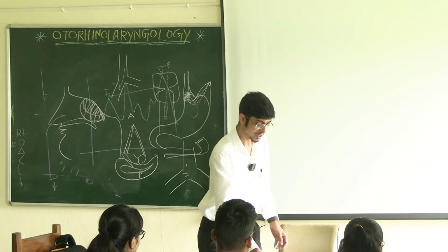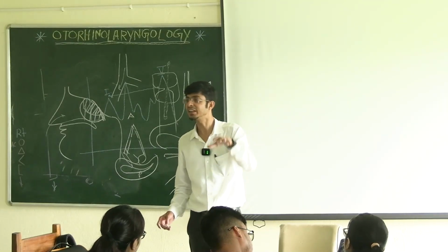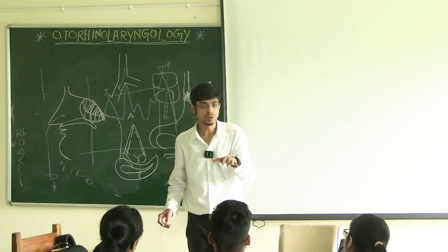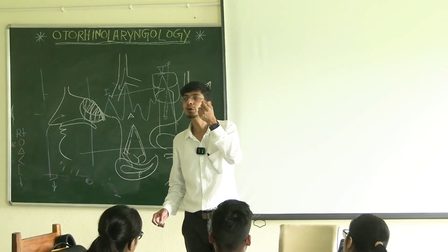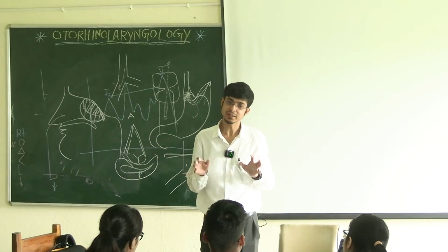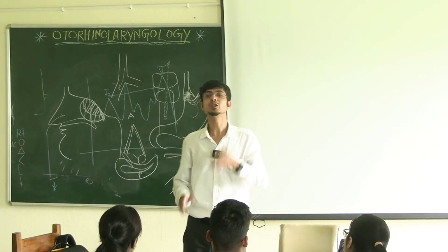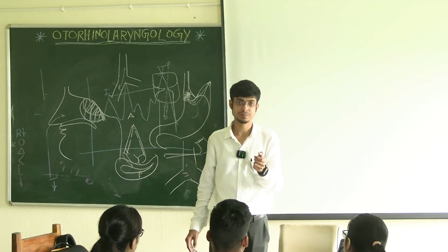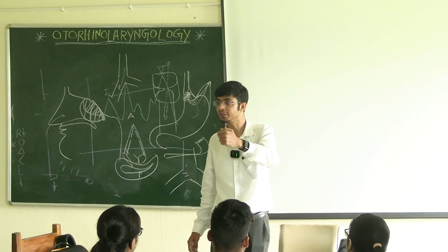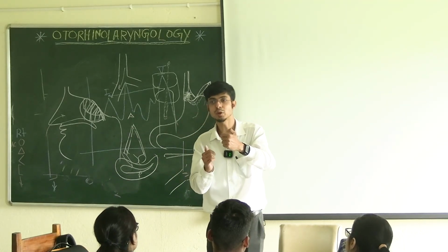So what we do in a bronchoscopy is put the general anesthesia. We deeply sedate the patient. We don't go to level 3. We deeply sedate the patient somewhere around 2. Okay. Then we put the tube. Then we ventilate adequately. Once the patient is properly ventilated, we use the anesthetist's laryngoscope. Okay. We see the glottis. We take the tube out and then put the bronchoscope through it.